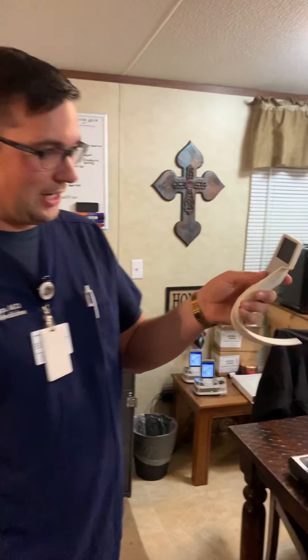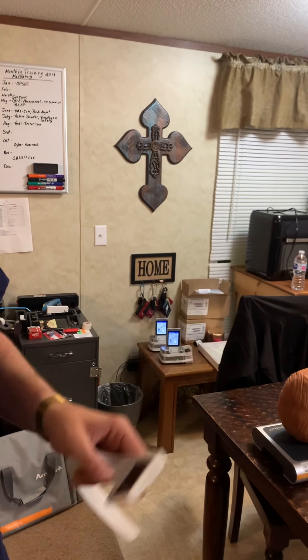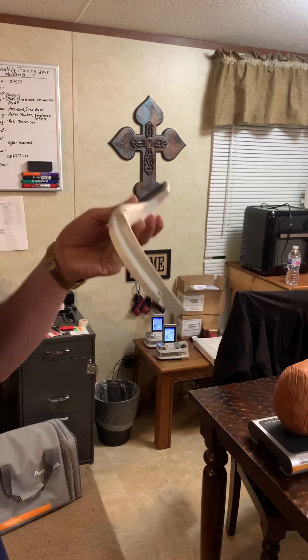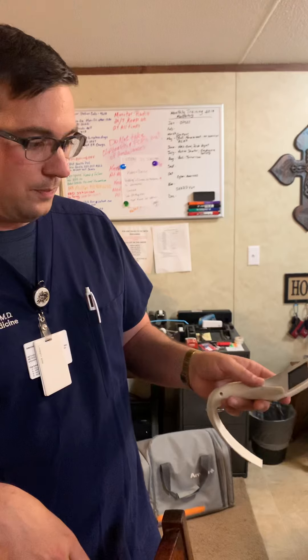So this is called the Intersurgical Video Laryngoscope. It's made by the company Intersurgical, which manufactures the iGel. This comes in a package just like the iGel packaging — you open that package up and then you have your laryngoscope. It's a five-year shelf life, completely disposable, no battery changing. You just use it and when you're done, you throw it out. Real simple.